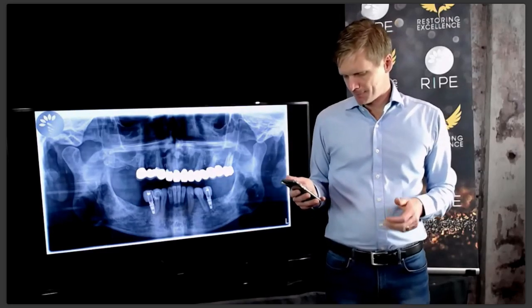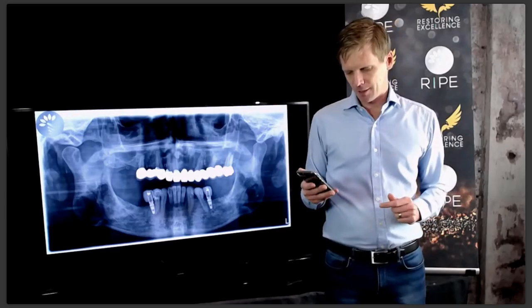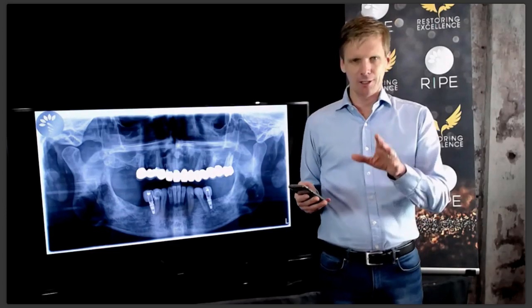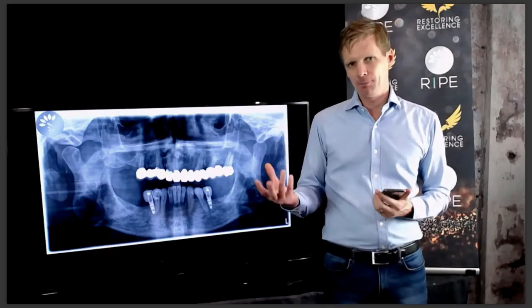This is from Callum. When putting a patient into a full mouth composite rehab and gradually transitioning into ceramic, is it worth making the posterior composite units all separate, or would you be splinting them? Okay, a lot of people try and do composite rehabs by using a stent.